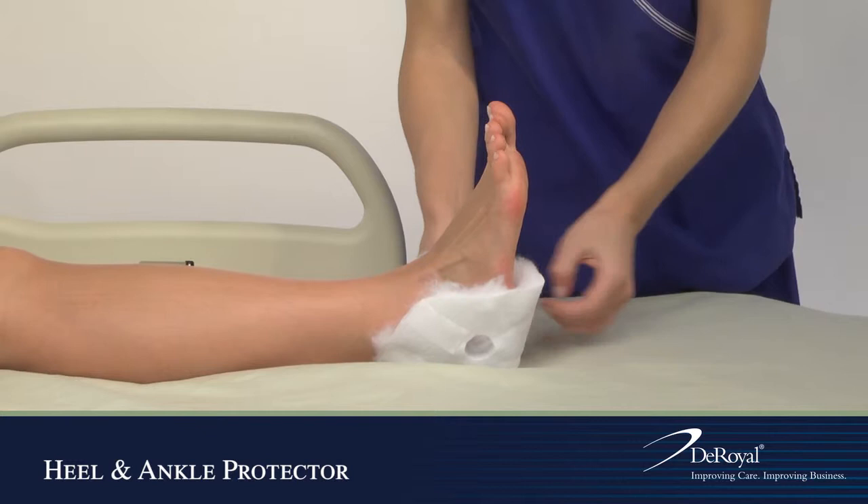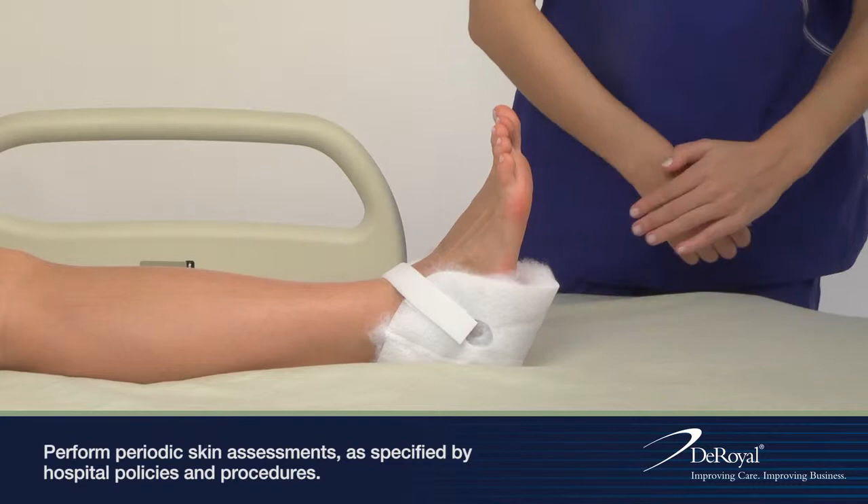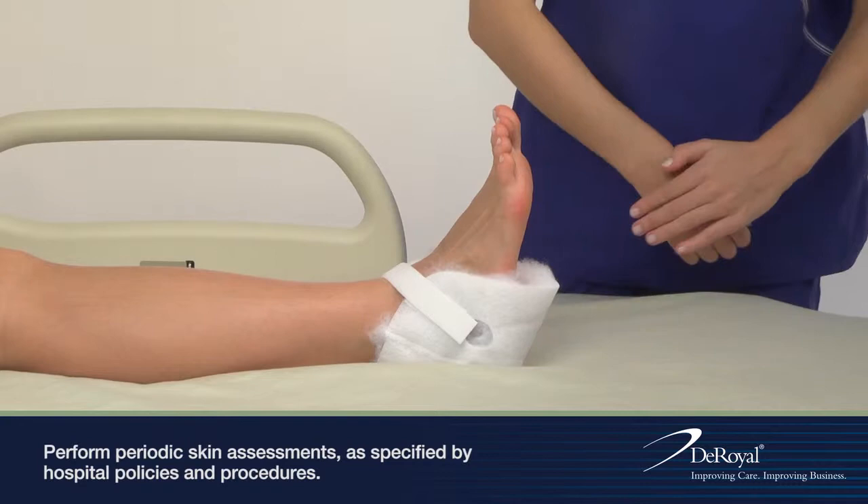Visually check to ensure patient circulation is not compromised. Perform periodic skin assessments as specified by hospital policies and procedures.